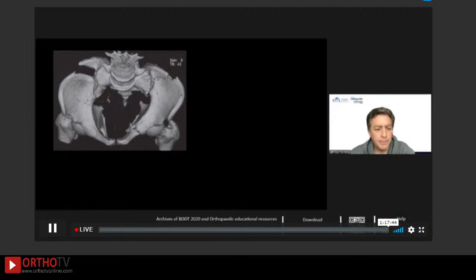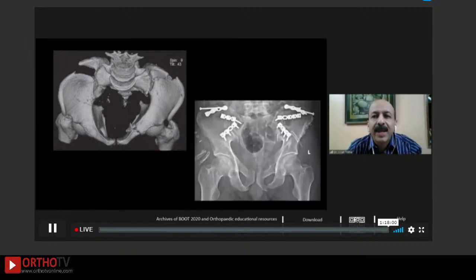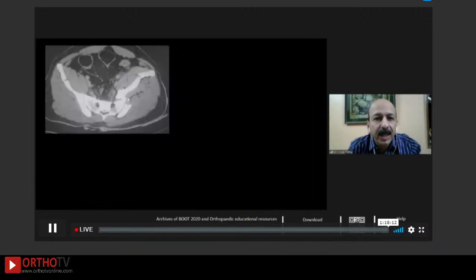That's an important point. This is another bilateral crescent. One, the classical crescent, which we see on the right, and on the left-hand side, the new variant, which we found with the anterior sacroiliac dislocation lying on the left. So we had two cases like this, where you can have a bilateral crescent having this fracture pattern. Again, we went from the lateral window, just lateral window from both the sides, and it gives you good reduction for both the fractures. He had some anterior injury and abrasion, so we didn't fix him anteriorly.